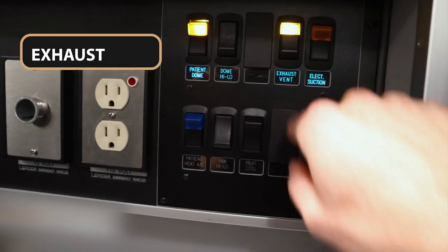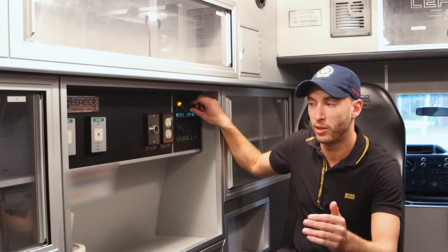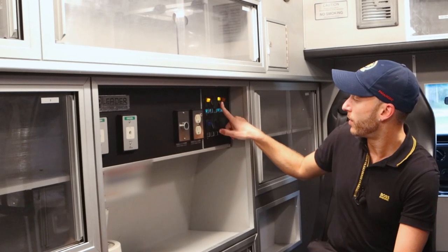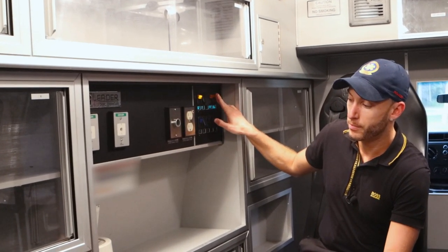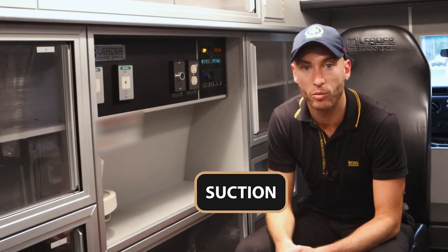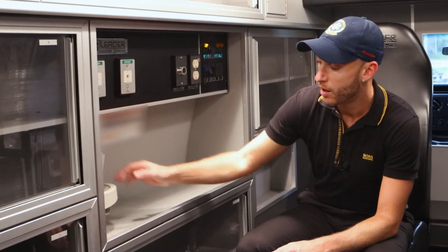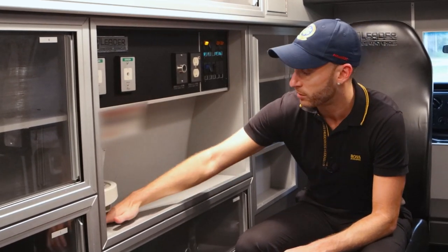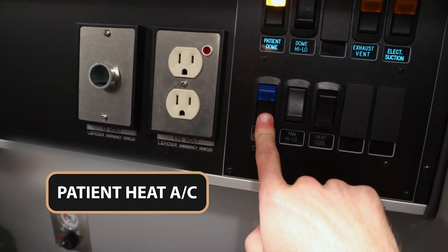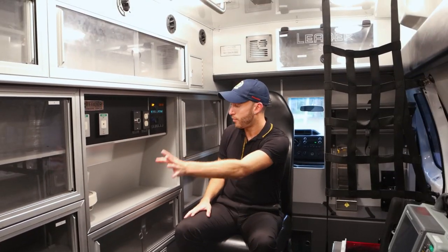The exhaust vent — so if we have a patient, say a respiratory patient for example, or for other reasons, you would use the exhaust. Now what you're going to hear right now — that is the actual suction coming out of here. There would be a suction catheter set placed here, and you have the actual suction supplies usually tucked in right underneath. That's going to be the heat and AC, and you have the fan settings over here. That's all we have over here on this side.